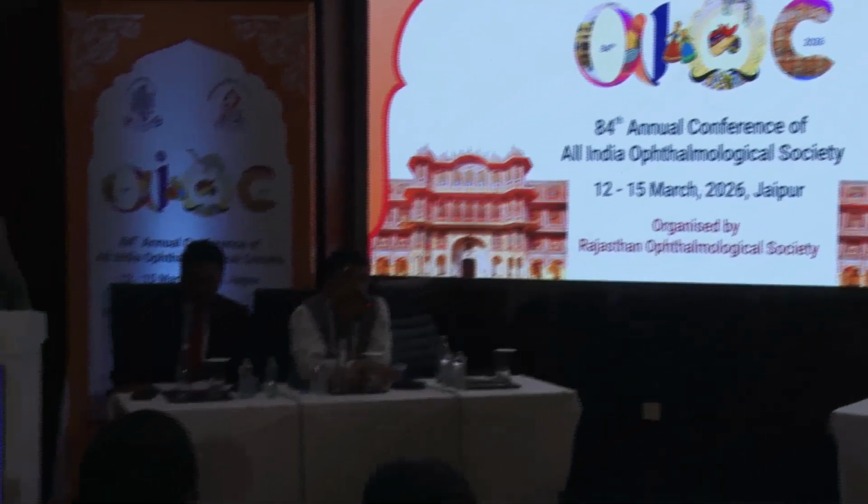Thank you. The most important thing is that the anterior segment surgeon should not have a thought block about doing the vitrectomy, anterior vitrectomy.